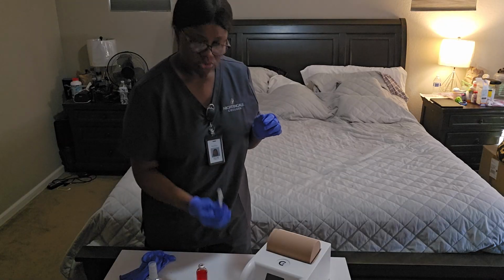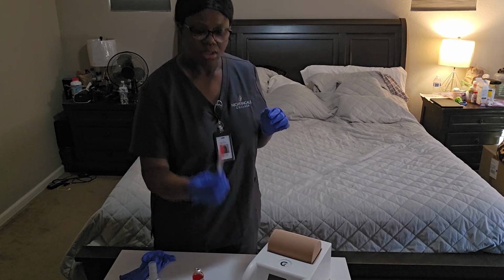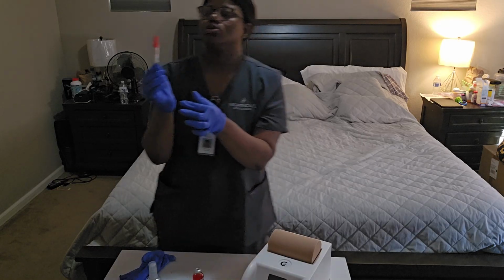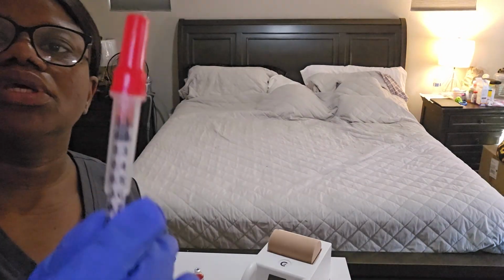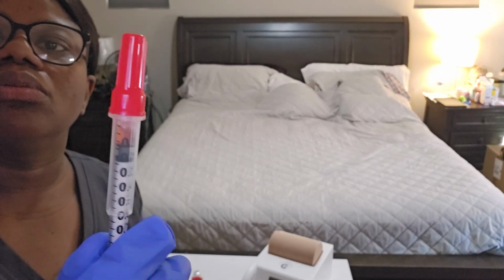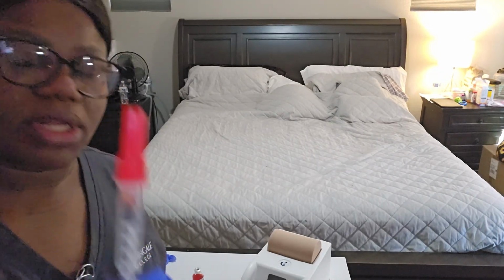So I'm going to do the one-hand scoop. I'm not going to touch it. One-hand scoop, and I'm going to close it. I'm going to come closer and show it to you guys. I don't know if you can see, this is 0.1 ml. There you go, 0.1 ml.